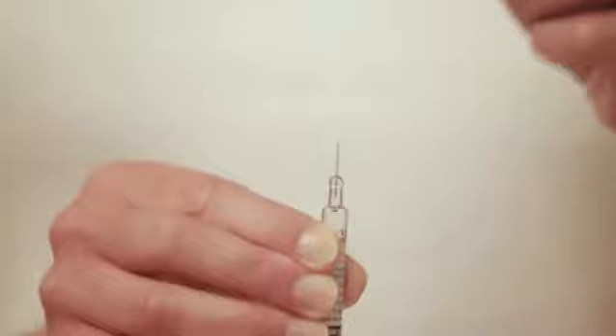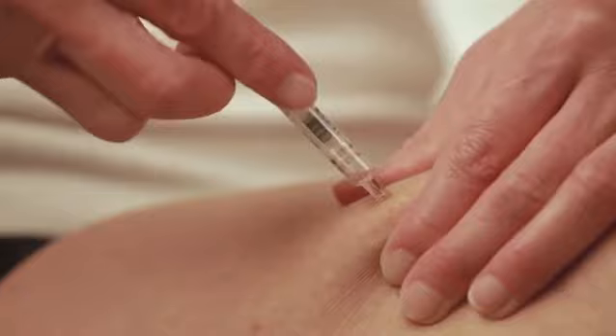If you do not see any blood, then slowly inject the contents of the syringe into the skin fold.